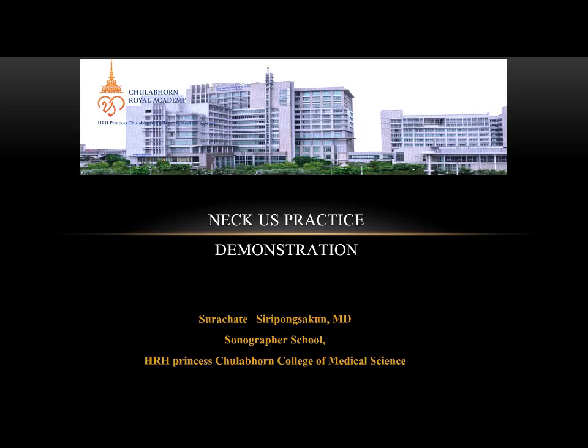Today, I would like to demonstrate the neck ultrasound in detail, beyond the thyroid. Neck ultrasound is considered a complicated ultrasound study because it contains lots of small structures inside the neck, including small muscles, bone and cartilages, nerves, vessels, and salivary glands. Lots of complex structures inside the neck.